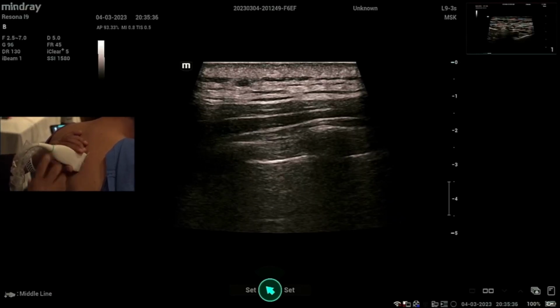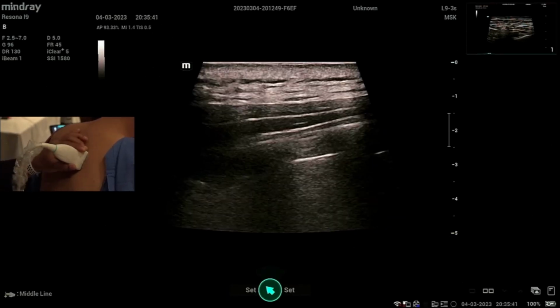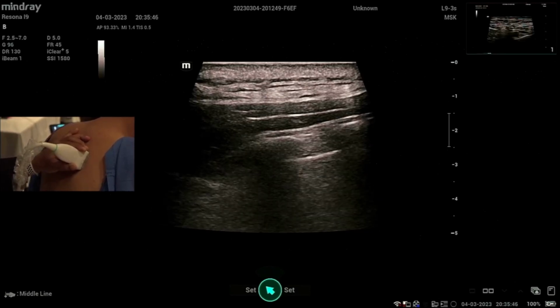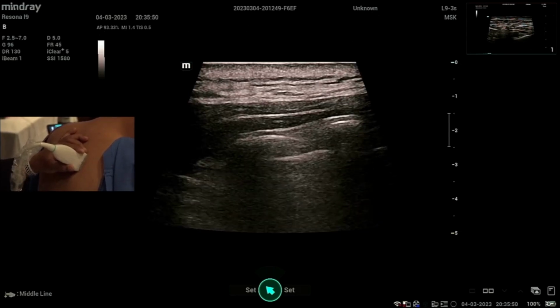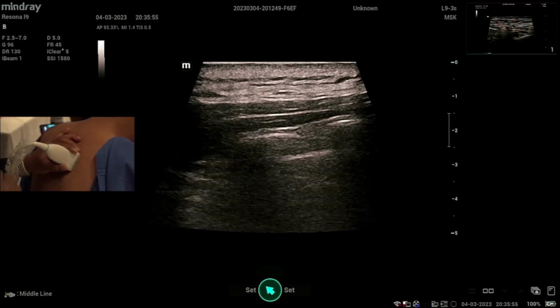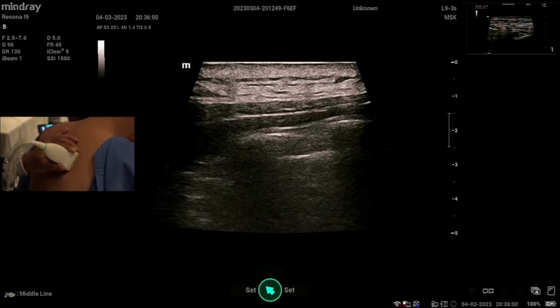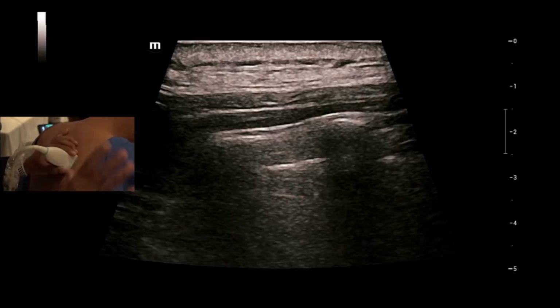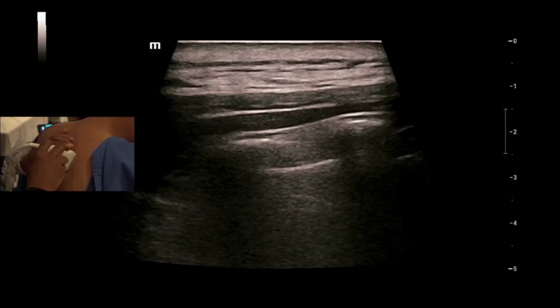This is as complicated as taking a picture with a manual camera, right? It's similar. This young man here has all these fancy cameras, and I also love them. I have my own toys, as I say. He has certain secrets, so you should develop these secrets as a sequence. Whenever you open an ultrasound machine, don't expect it to give you the image that you see in the books. The image is what you create. And the machines, depending on the machine, will offer you that.